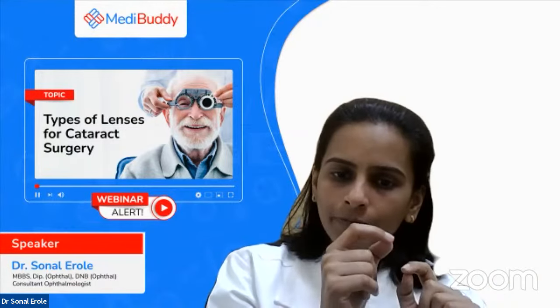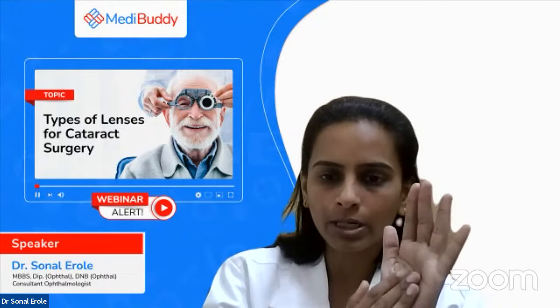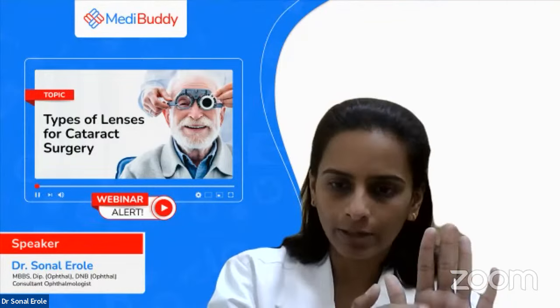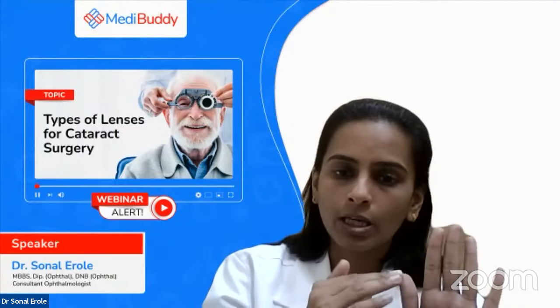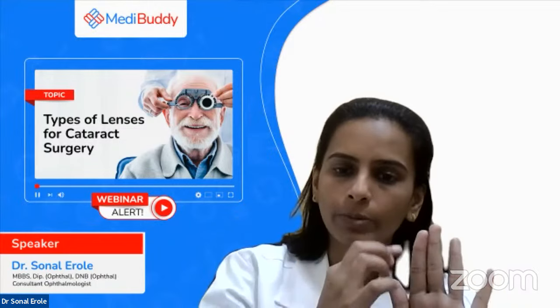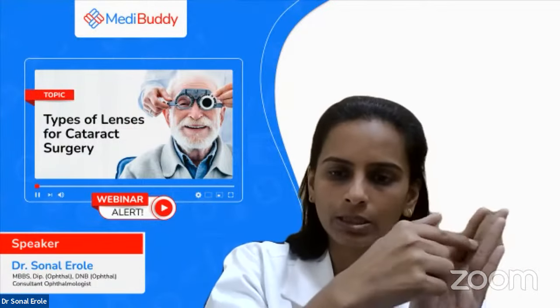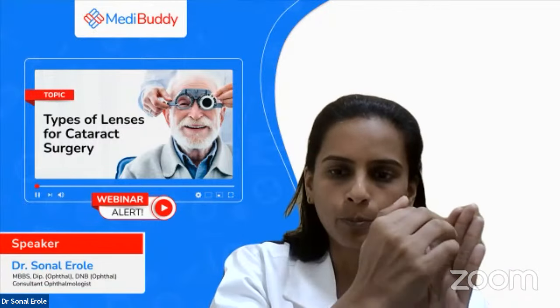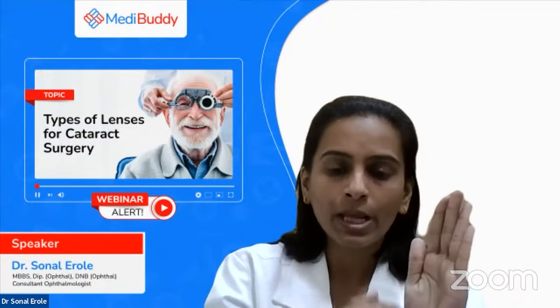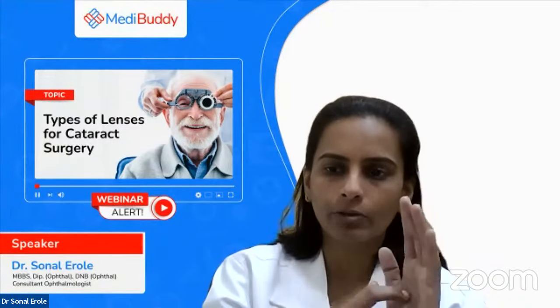So these are small advances over the normal lens. If you are making it hydrophobic, then definitely its price will be more. If we are making it a yellow lens, its price will be more. If we are making it square edge, what does that mean? When the lens is put in the bag, its back surface is square edge, so it will fit snugly with the bag, and posterior capsular opacity, or jala formation, will be less.